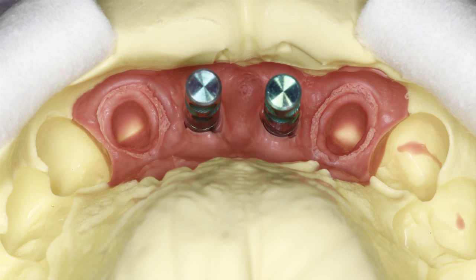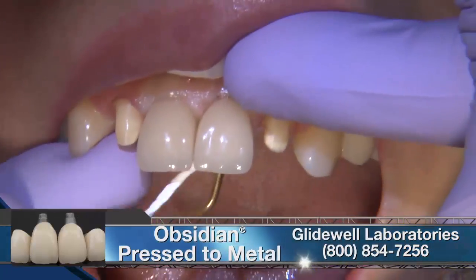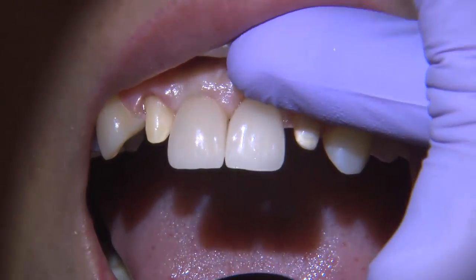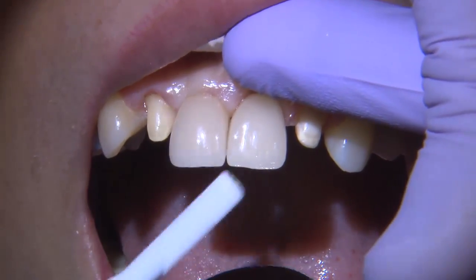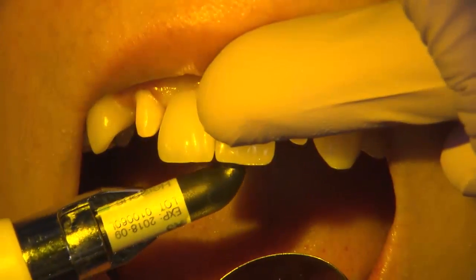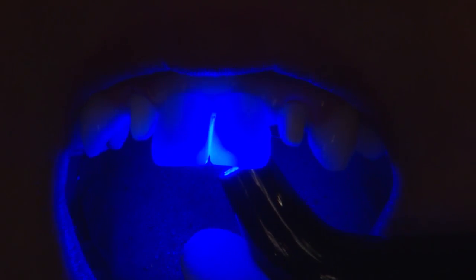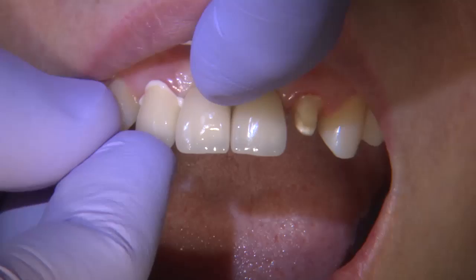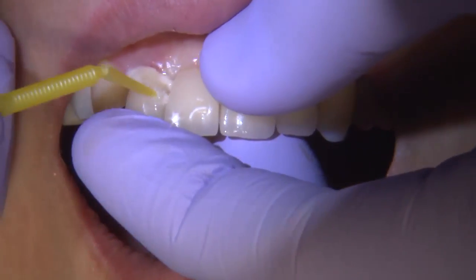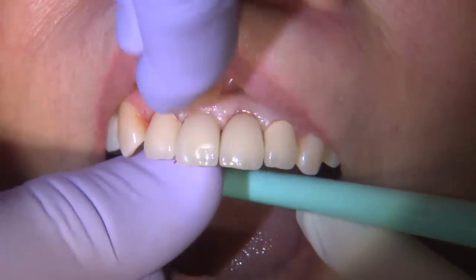One restoration I've found very successful — when a patient and clinician prefer a porcelain-fused-to-metal type of restoration — is the Obsidian to metal, which has been extremely aesthetic and very acceptable in terms of final results. That's exactly what I prescribed for this patient: Obsidian to metal restorations for both the implant restorations on the centrals and the laterals on natural teeth. After a try-in stage, I delivered the centrals as screw-retained implants, placing Teflon and composite. Once those were delivered, I went ahead and delivered both laterals, cementing them as I would traditionally cement any PFM restoration, then taking the patient through cement cleanup.